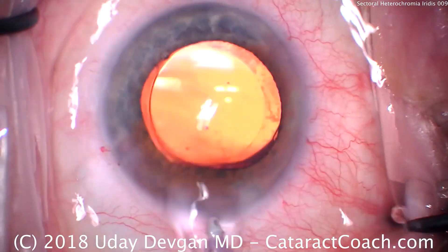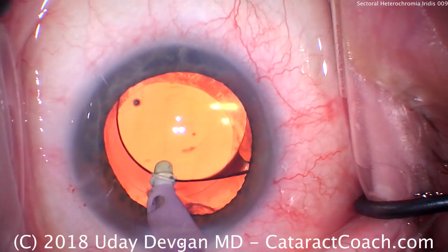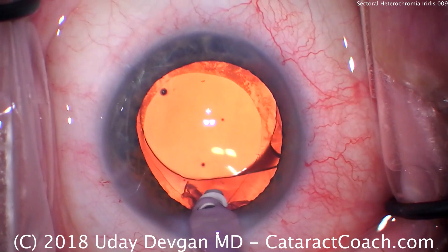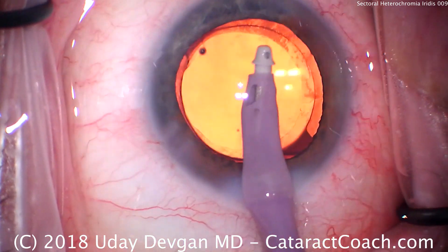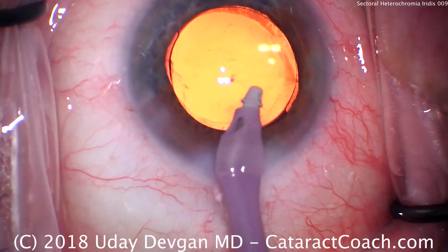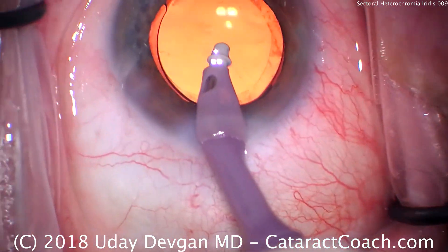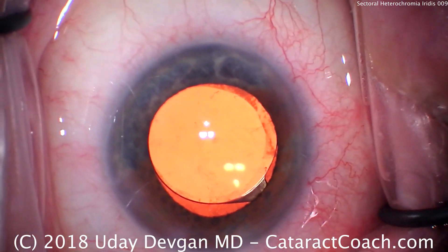The IA probe is going in the eye. We'll go to the subincisional area — looks like we're going behind the lens first to remove viscoelastic. Center up the lens, and then we can grab the last of that subincisional cortex. So now we've fully removed the cortex. Removing all the viscoelastic. Looks like we have a pretty good overlap of the rhexis over the optic edge. Do remember that the capsular bag will shrink-wrap down and this capsulorhexis will end up being a little bit smaller in the next couple of weeks.